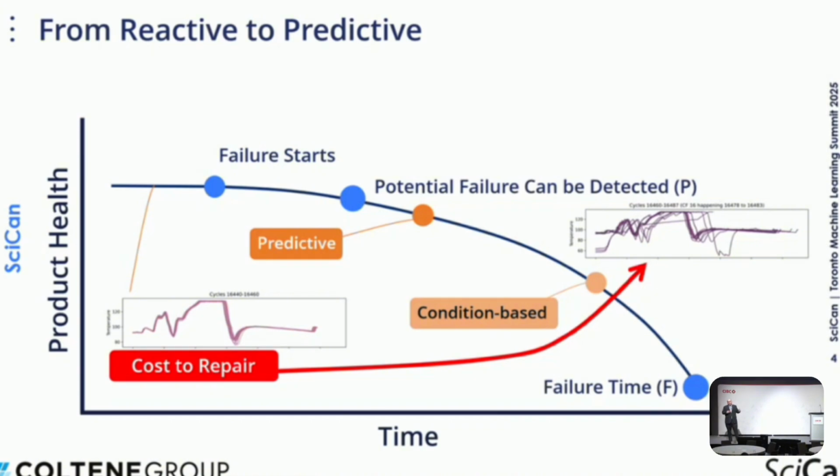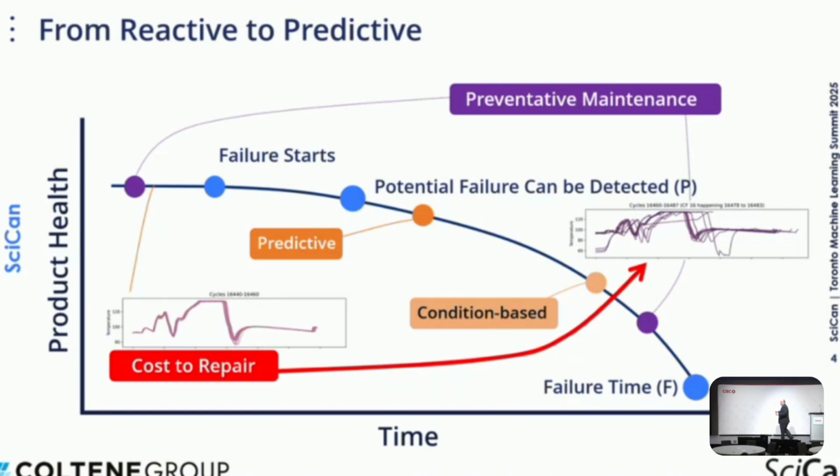And that will come out of the pocket of the clinician or the company that is providing the warranty of the equipment. And in the traditional context of preventative maintenance, that tells you, hey, have it checked every 500 cycles, have it checked every 6 months. That maintenance could come quite early when the maintenance is not really needed, or quite late when it's actually not helpful anymore.